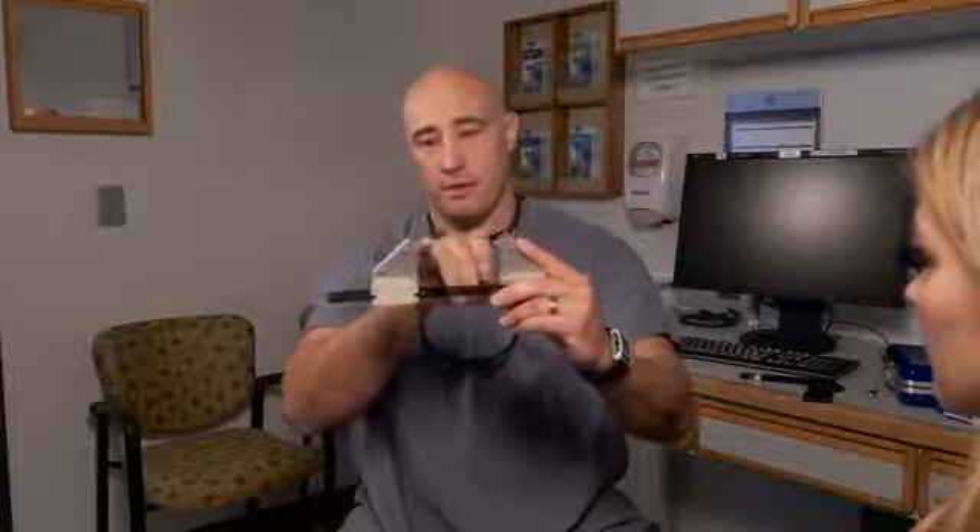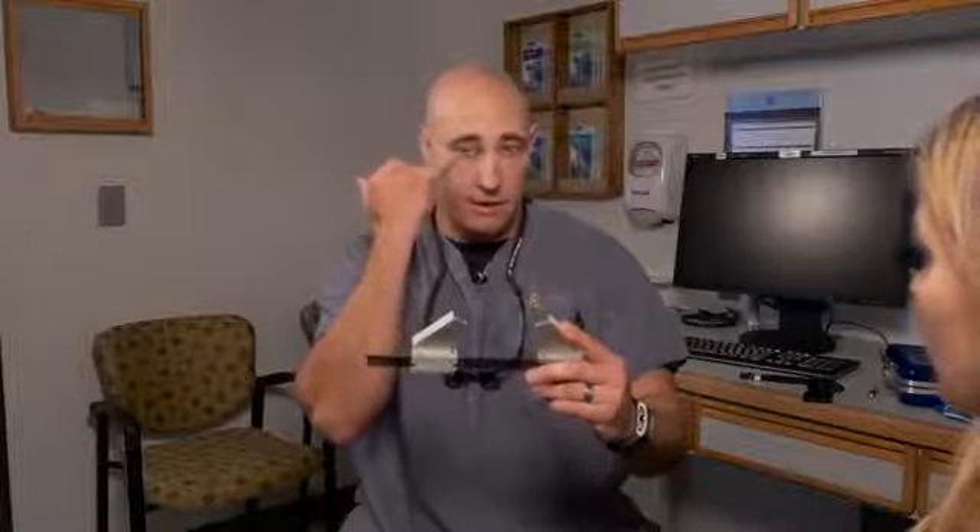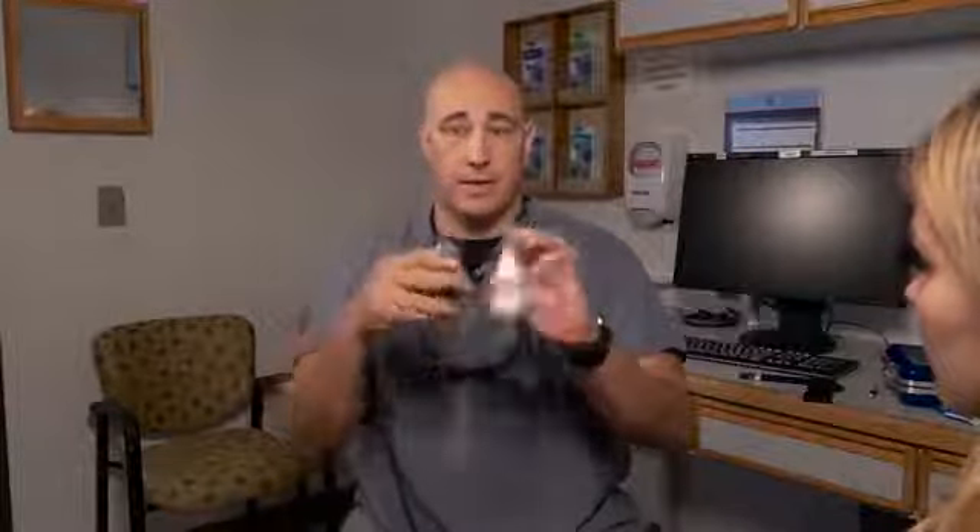Moving on to the orbital exam — I want to check if one eye is farther forward than the other, so we're going to use an exophthalmometer to measure for relative proptosis or enophthalmos. This works well if a patient has normal bony structure; it can be confusing if they have fractures or facial deformities. The curves of the exophthalmometer rest right inside the lateral orbital rim. I use the lateral canthal angle as my target — where it hooks into the lateral orbital rim. This can cause a little pressure sensation, and especially with fractures try to get bony contact for accurate readings.